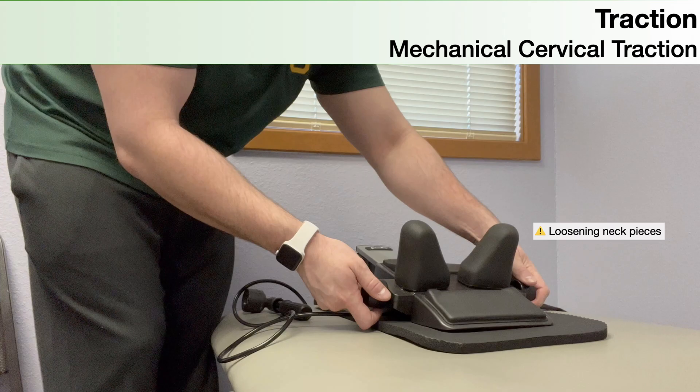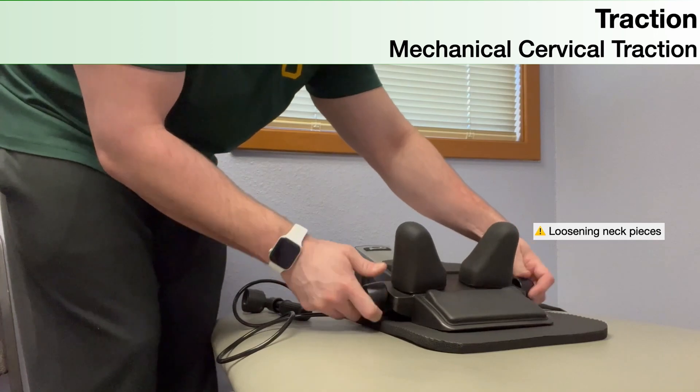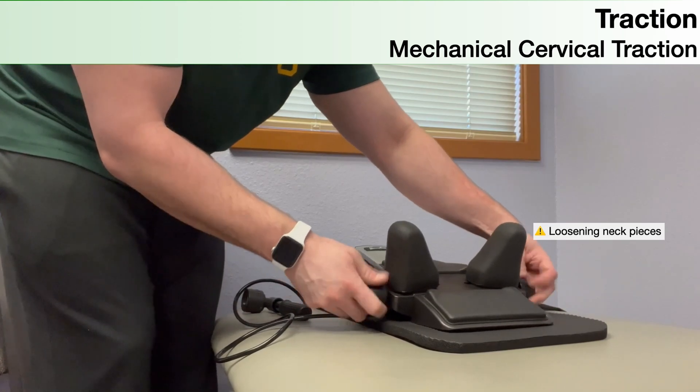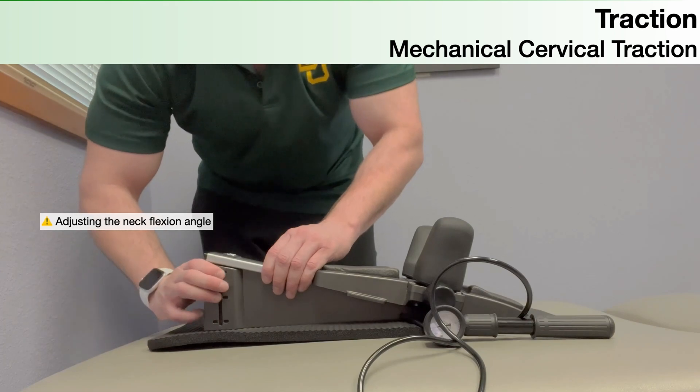Once you have the mechanical cervical traction device in position, loosen the neck pieces by rotating the knob so the person can lay down and get their neck between the neck pieces before you tighten it back up. Then adjust the neck flexion angle.